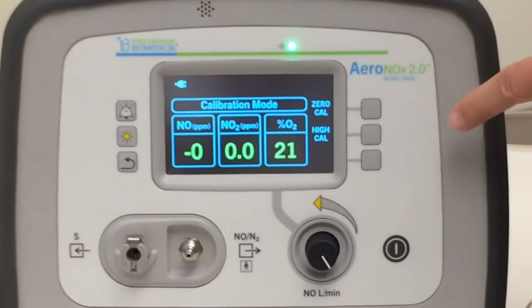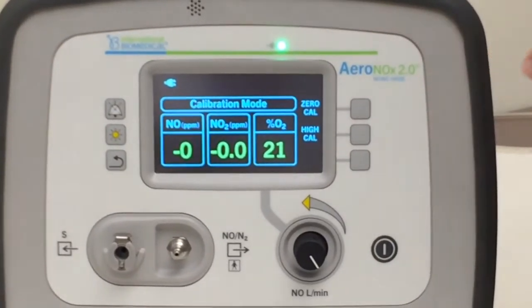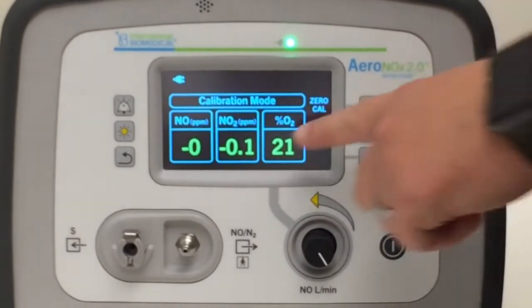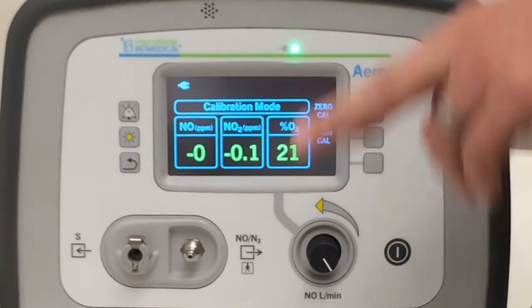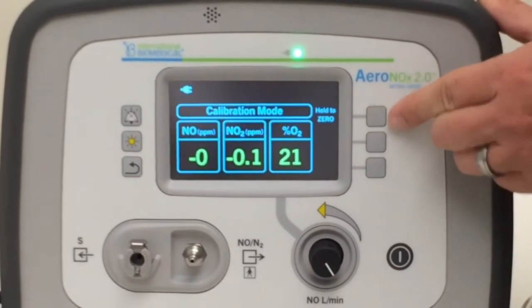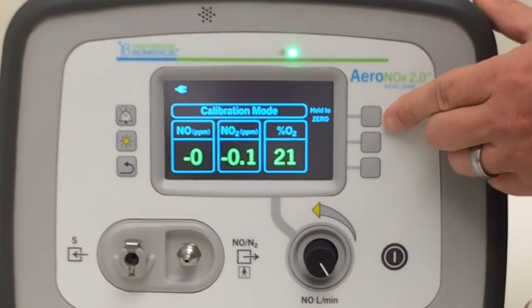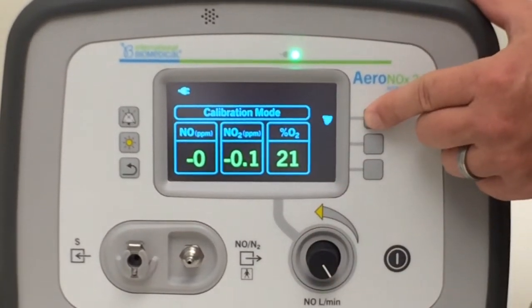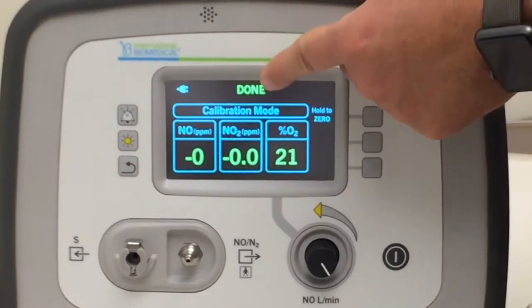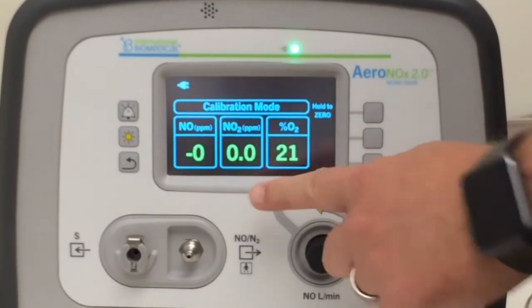We always start with a zero CAL. This is a big improvement on the older unit because we can zero everything at once — we used to have to go through them one at a time. So we'll hit zero CAL. This gives you your low CAL for all the cells. Hold this down until the pie completes itself, and then it says done, and we've given a low CAL.